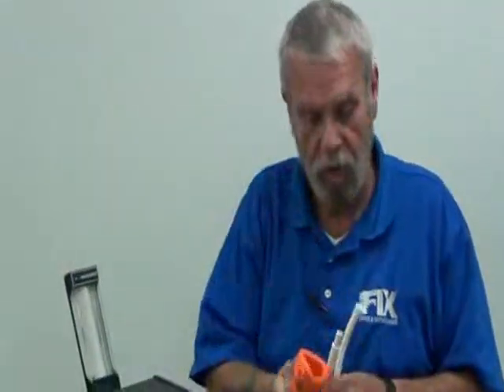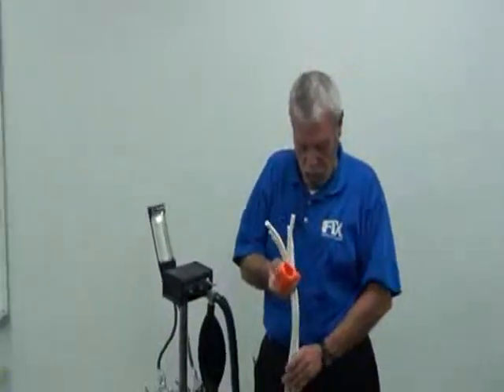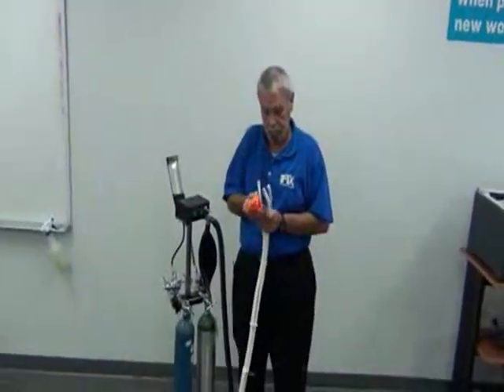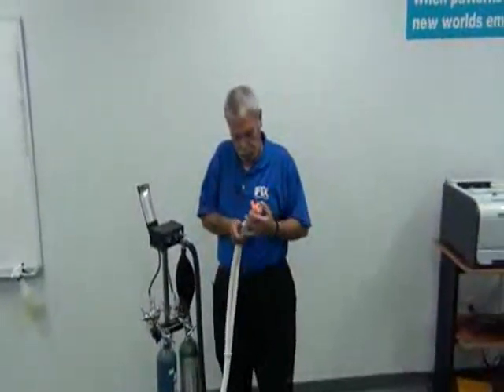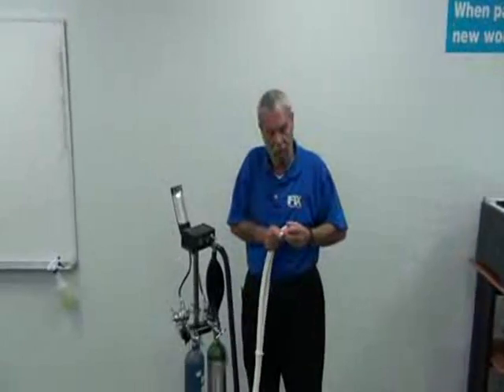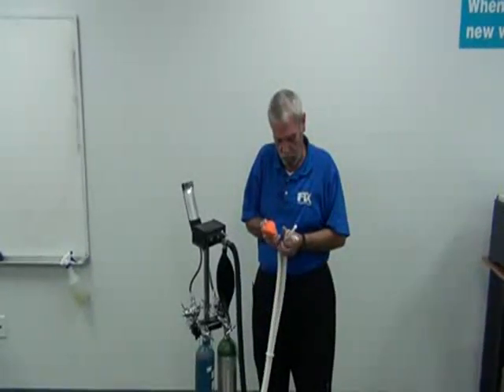The doctor then tells the patient, after he's placed this on the patient's nose, to breathe through your nose, and exhale and inhale through your nose only. That way, they're getting full benefit of the analgesic. They're getting full benefit of the mixed gas.